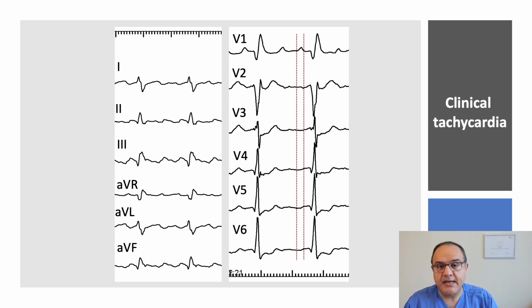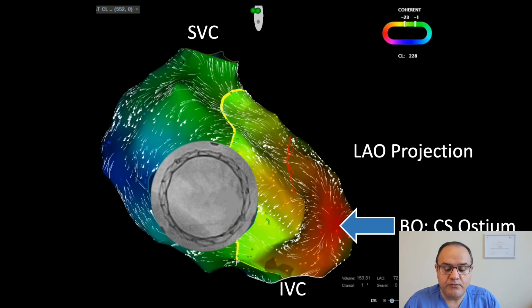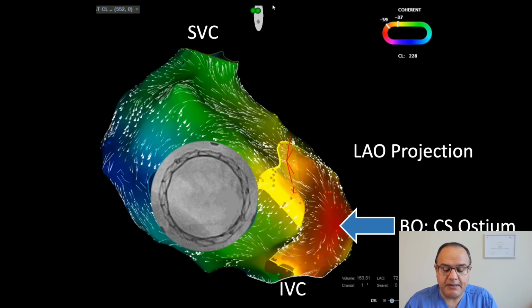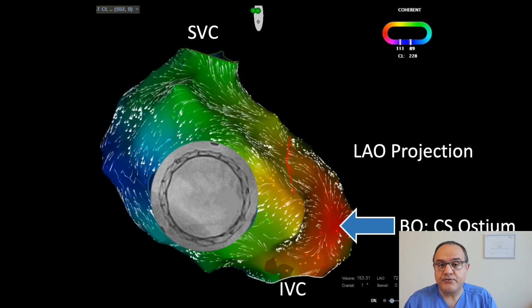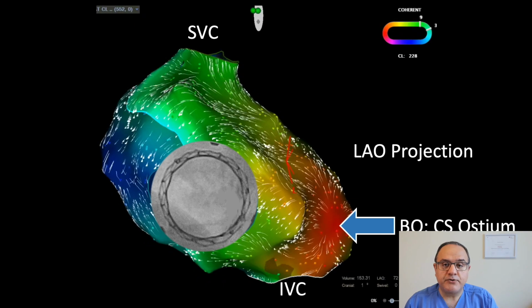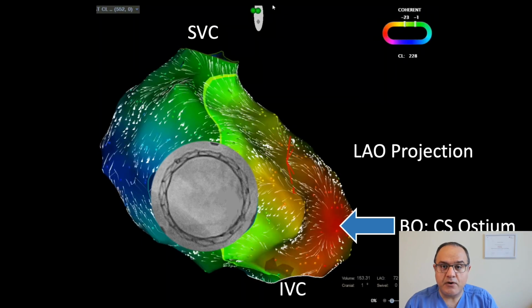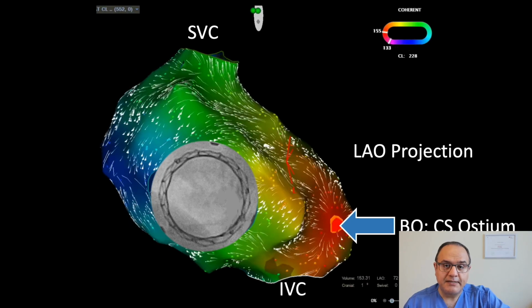After placing the catheter, the entrainment mapping, however, was not compatible with the diagnosis. And now we see the high resolution mapping of the right atrium during tachycardia. Here we see the propagation mapping, and this map also confirms the finding of entrainment mapping that this tachycardia is not a macro-reentrant right atrial tachycardia.